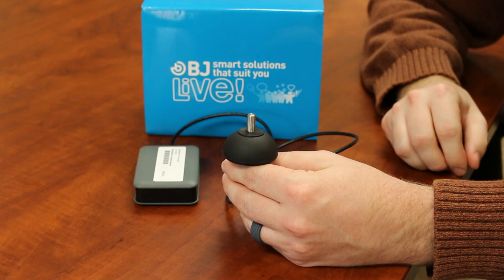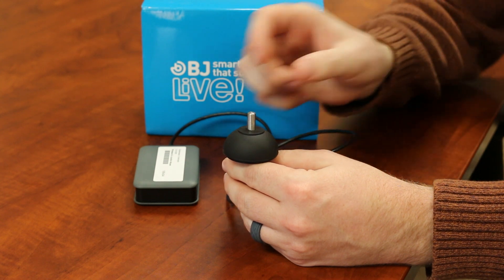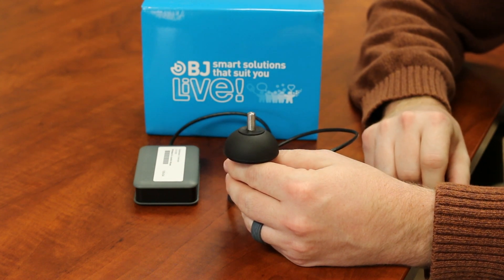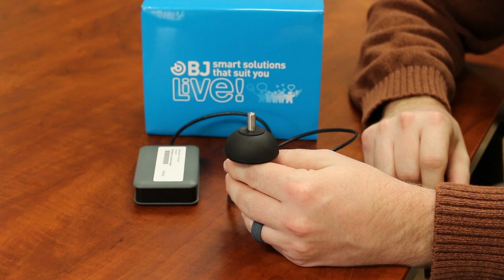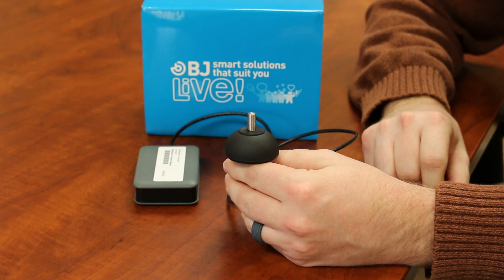Hi, my name is Justin Namber and I'm the Equipment Loan Specialist for the INDATA Project at Easterseals Crossroads. Today I'm going to show you the BJOY wireless joystick. The wireless BJOY joystick allows you to operate a computer by switching over from operating the wheelchair and using the joystick on the wheelchair as the command center to operate a smartphone, a tablet, or a computer.